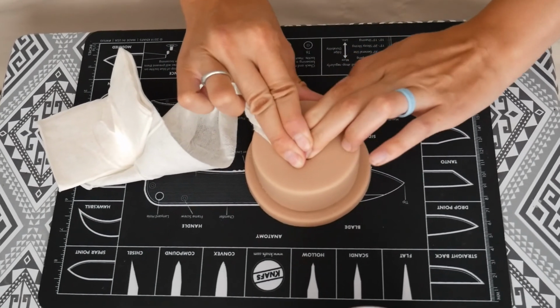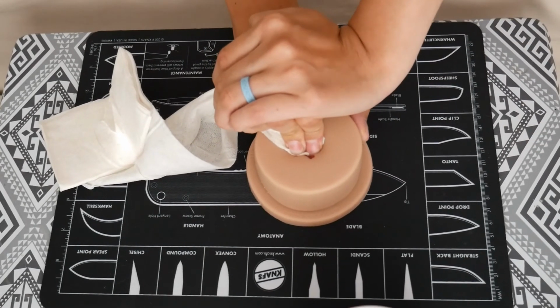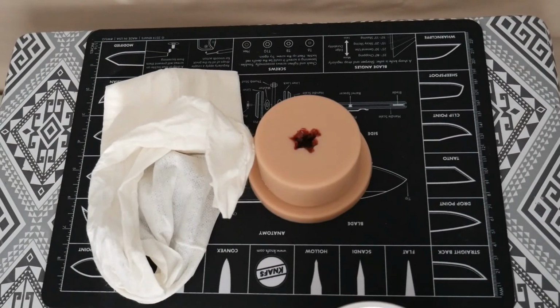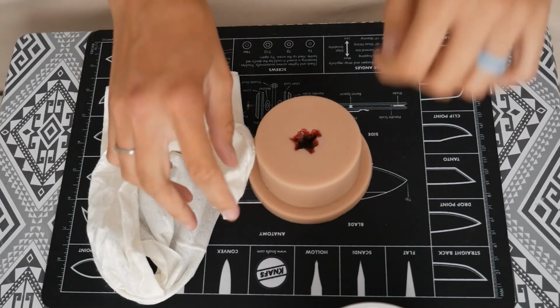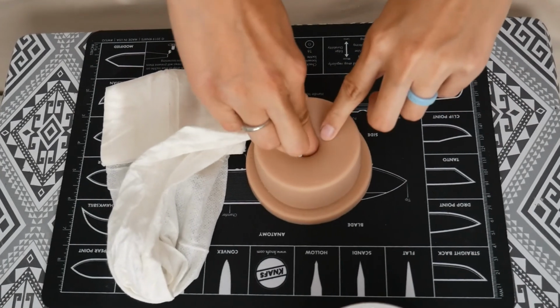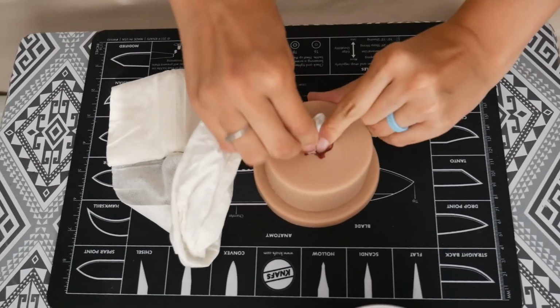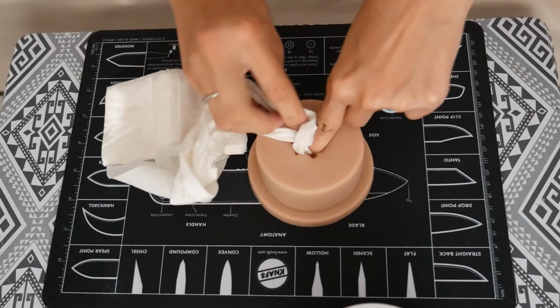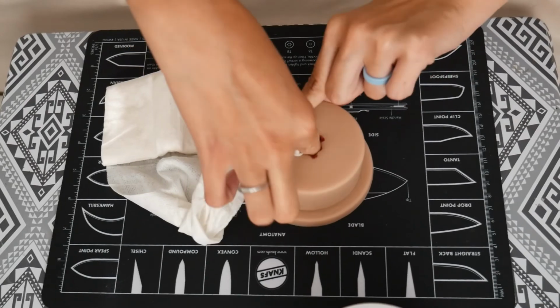Wound packing is basically a life-saving measure that you would use in the most severe situations, because like I said, it doesn't take very long to bleed out. Anyways, I hope you guys thought this video was informational. Just a reminder, do not use this unless you have official training and certification, and you also have approval from your medical director and supervision from whoever you need supervision from. I just don't want anyone to get hurt, but this is good information to know.